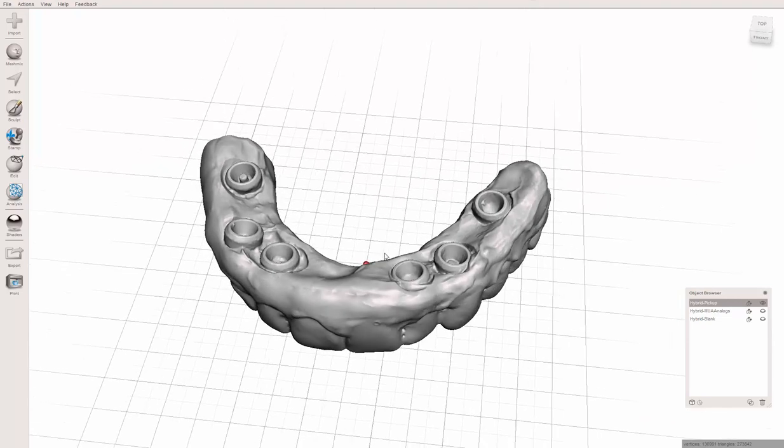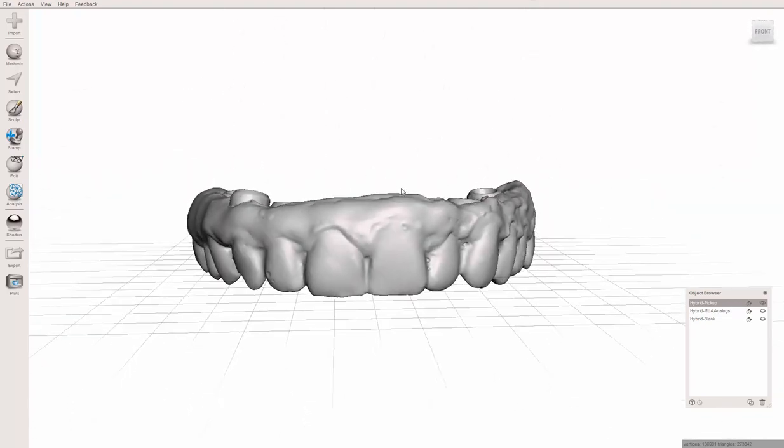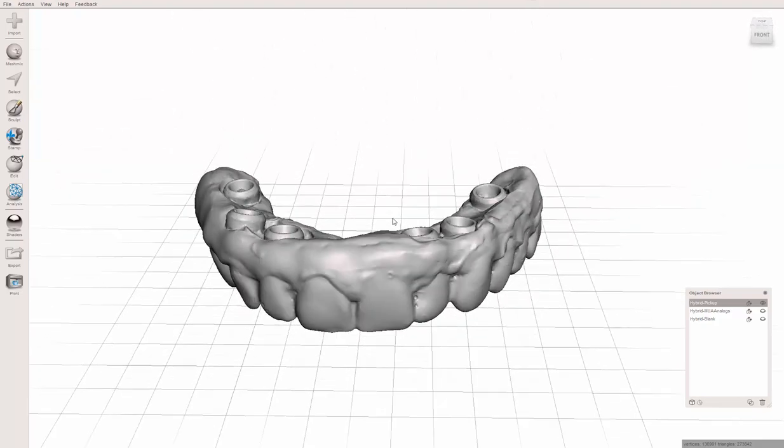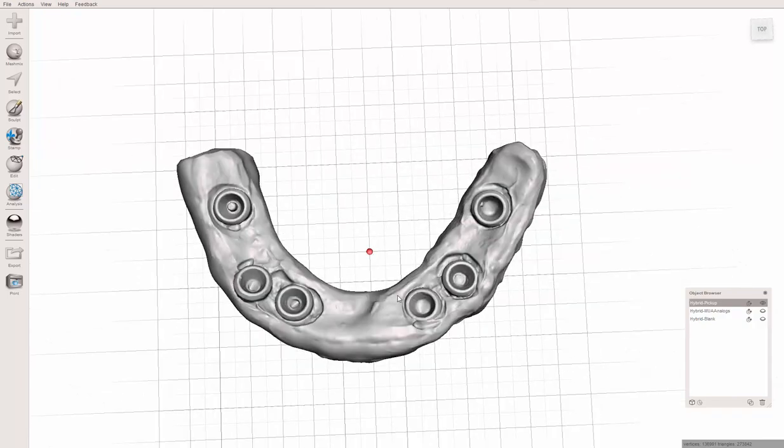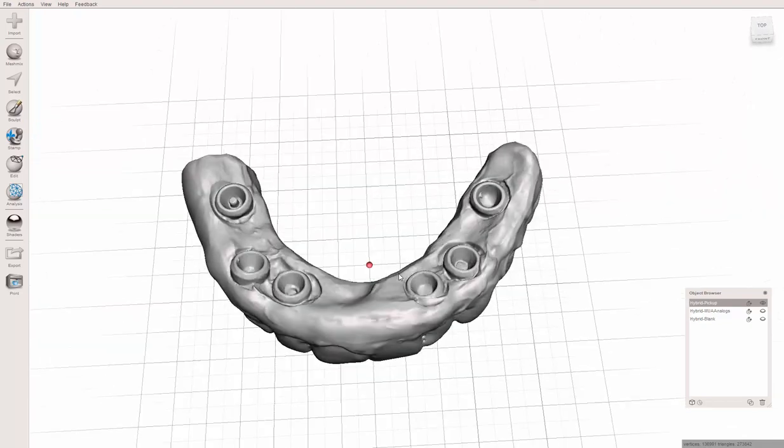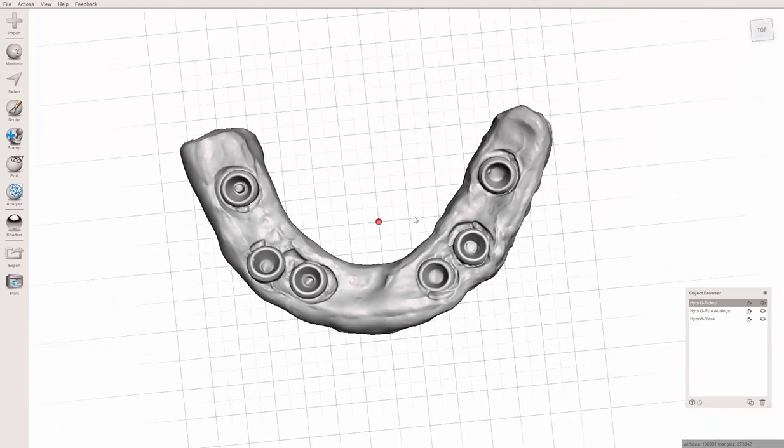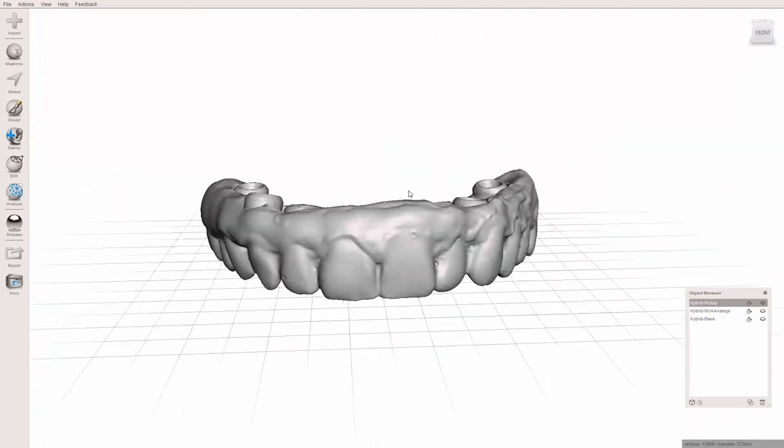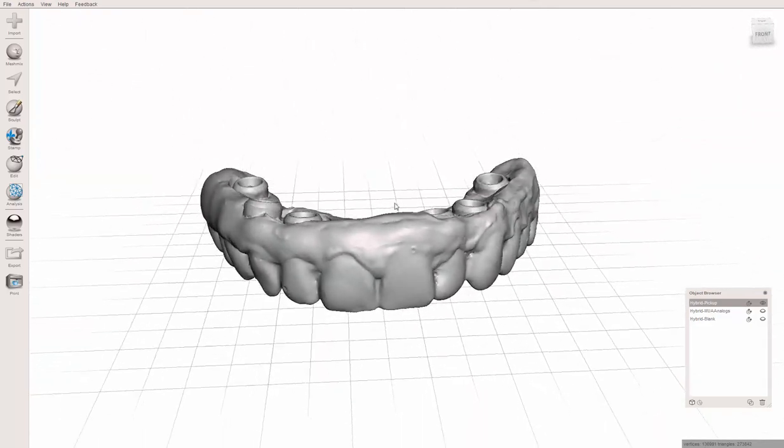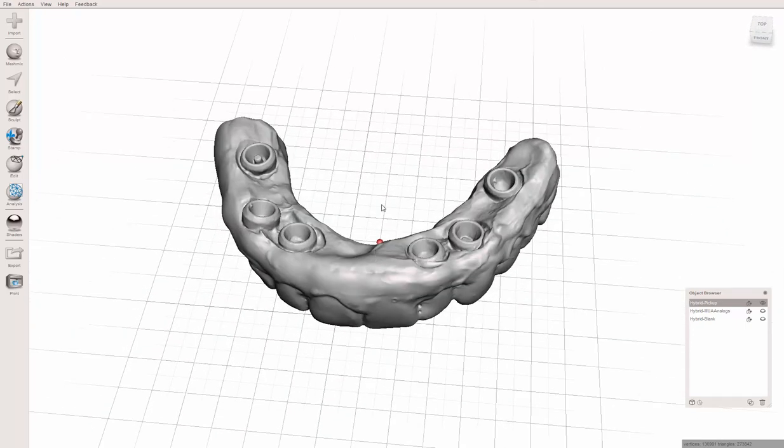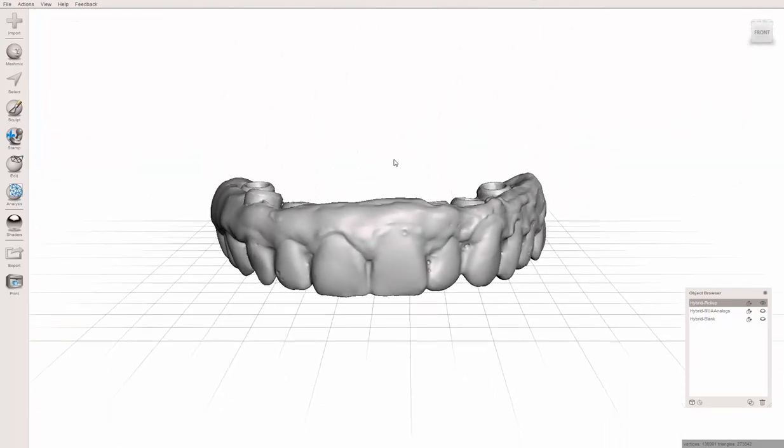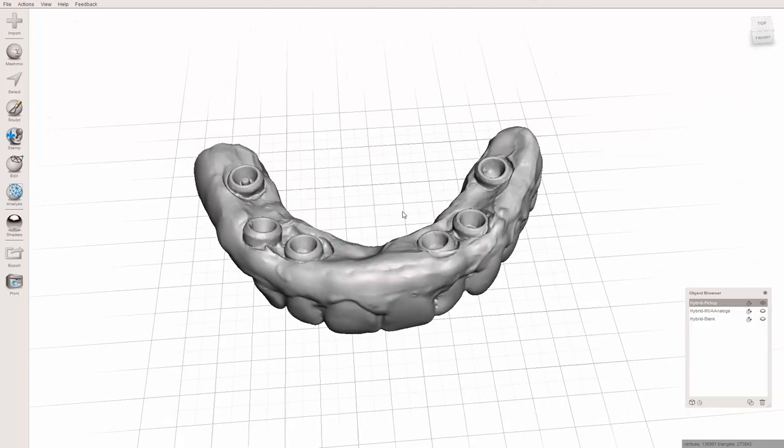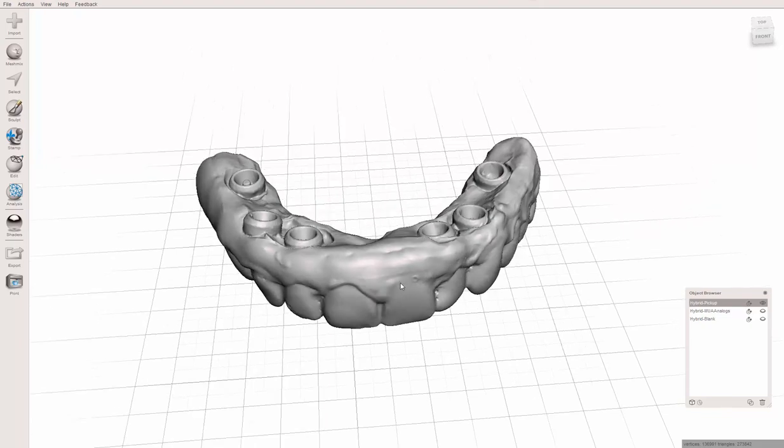It relies on you having access to some STL files for whatever multi-unit abutment analogs you use. Some softwares already have this ability - Exocad and 3Shape have it if you use the right scannable analogs. This is also going to be added directly into BlueSky Plan, so you won't need to use MeshMixer. Hopefully this is helpful to those of you that are interested in tinkering as well.